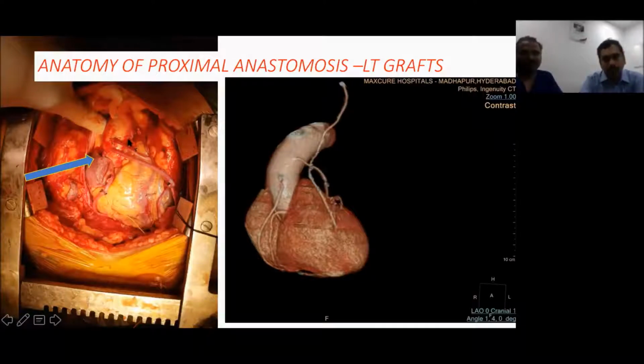But posterior grafts happen only on rare occasions where the aorta is very atheromatous, and that is the only soft spot that we have got. And sometimes after bypass surgery, most often these patients are very elderly, so if there is any aorta dilatation, though the surgeon gave it on a lateral aspect, because of its dilatation it may become posterior. I think that's the most common scenario, rather than the surgeon going and giving it in the posterior aorta. Which is not practically possible, right?